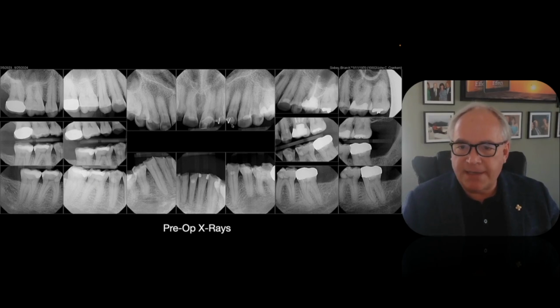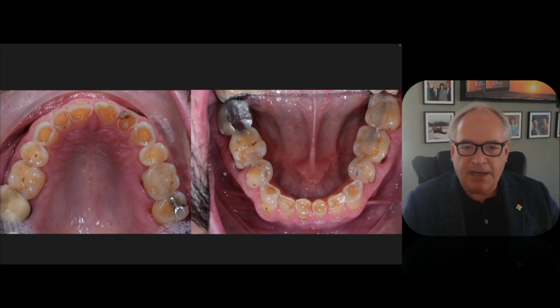I was a little worried about 10, not a lot of tooth structure on 10, but I also have, as you'll see, a tooth that's erupted and the tissue has come down with it. So crown lengthening in this area is going to expose more tooth structure for me to get a ferrule effect. So there's nothing here that I thought needed to be removed.